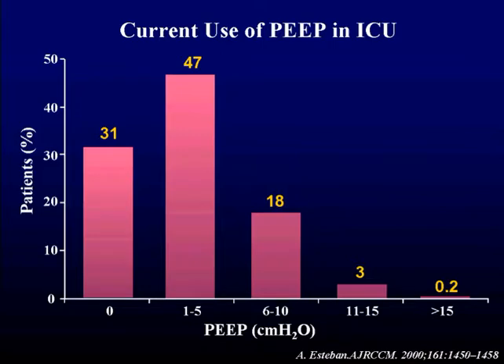Reality looks a little bit different, and this is a nice study done by Esteban, published in the Blue Journal a year ago, in which they tried to study how mechanical ventilation was applied in a number of ICUs. More than 400 ICUs were included, and among many interesting findings, they could see that almost 80% of the patients were ventilated with PEEP levels below 5. When discussing this result, they came to the conclusion that this low level of PEEP was applied without any strategy, any concept, and it was more a specific directed order on the medical charts.